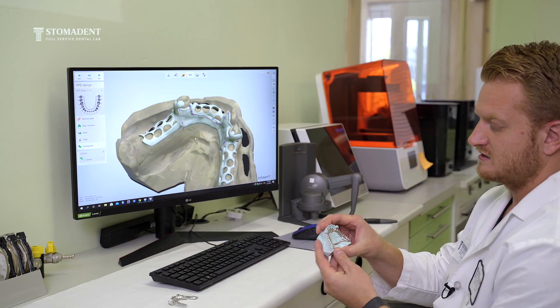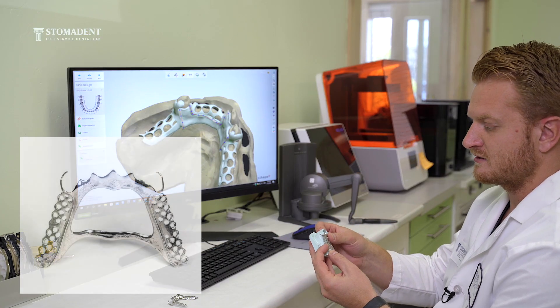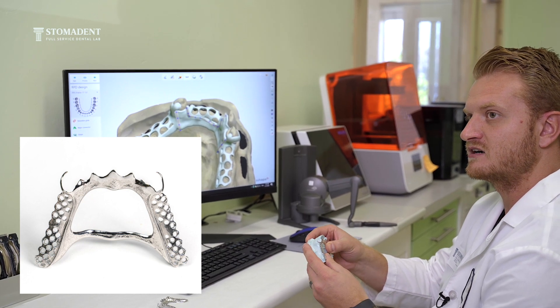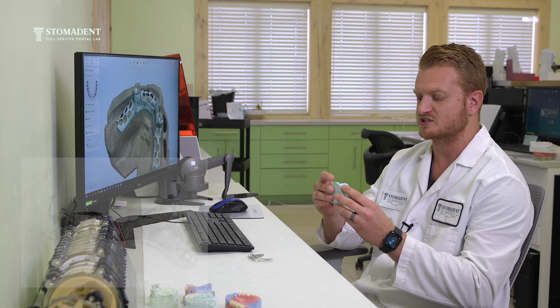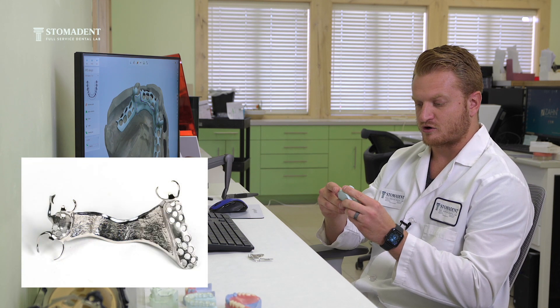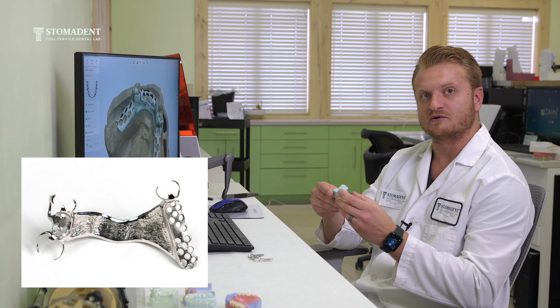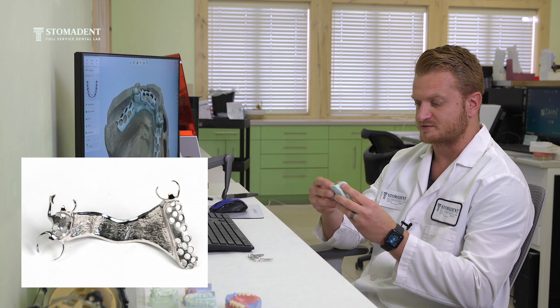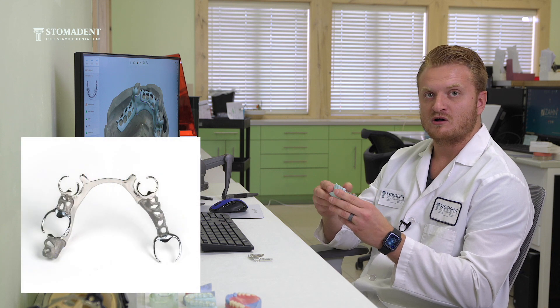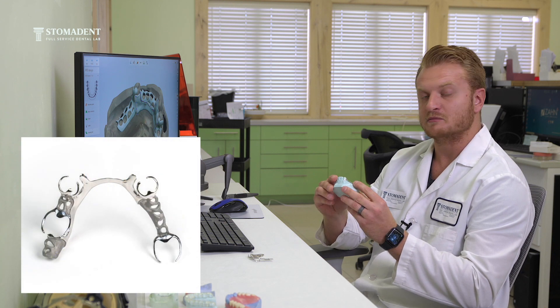The newest type of frameworks we have in the lab right now is these titanium frameworks. The number one great thing about them is the fact that they are much lighter than a conventional wyronium framework or any other chrome cobalt type of partial denture.